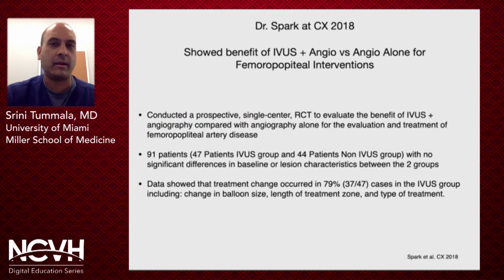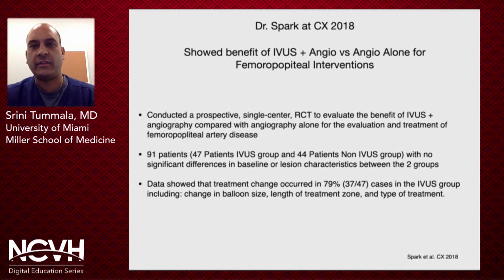Here's some data that was presented by Dr. Spark at Charing Cross in 2018. Again, his team showed the benefit of IVUS plus angiography versus angiography alone when dealing with femoral popliteal interventions. What they did is they conducted a prospective single-center RCT to evaluate the benefit of IVUS plus angiography compared with angiography alone for the evaluation and treatment of FemPop disease. Their study included 91 patients, relatively equally divided between the IVUS group and the non-IVUS group, with no significant difference in baseline or lesion characteristics between the two groups.